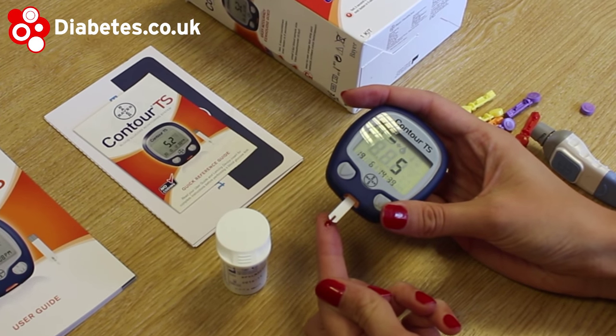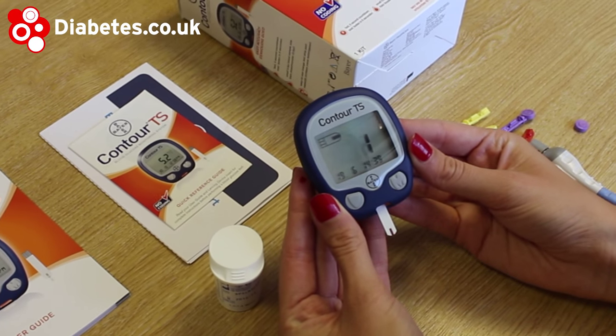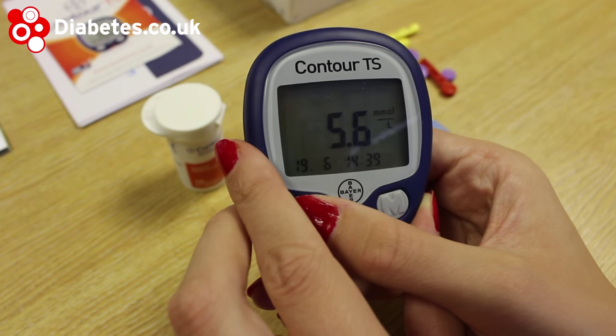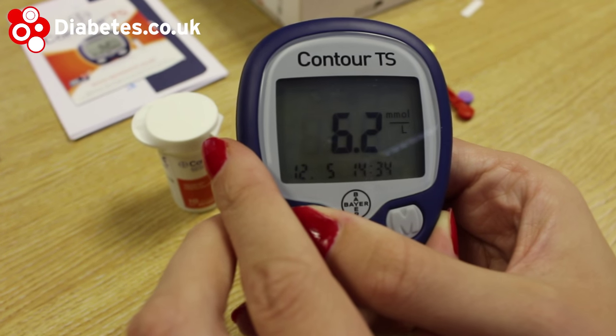In order to view your 14-day average, press and hold the M button. From there, pressing the down button will let you scroll through your past results. You can only scroll in one direction, but if you don't need to record a huge number of results, this shouldn't be a great problem.